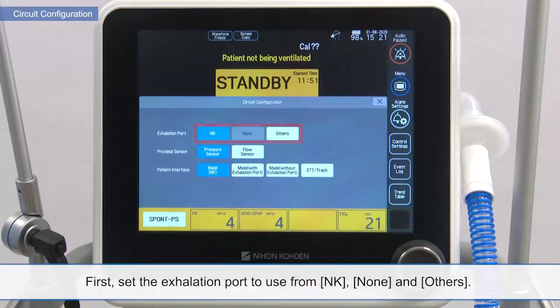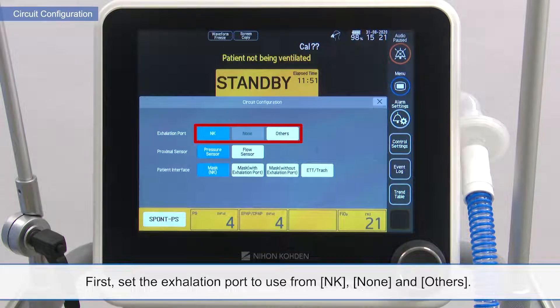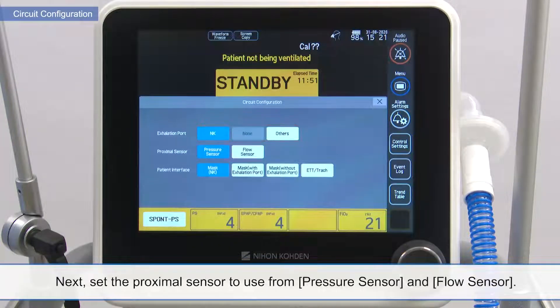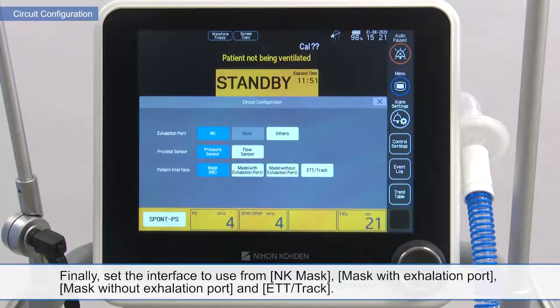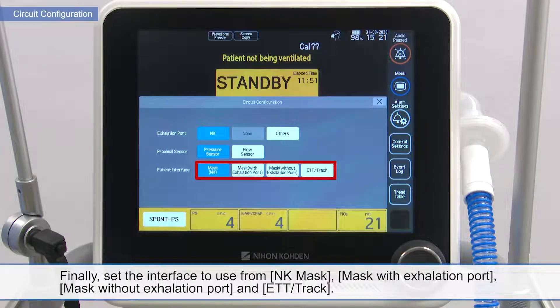First, set the exhalation port to use from NK, none, and others. Next, set the proximal sensor to use from pressure sensor and flow sensor. Finally, set the interface to use from NK mask, mask with exhalation port, mask without exhalation port, and ETT/trach.